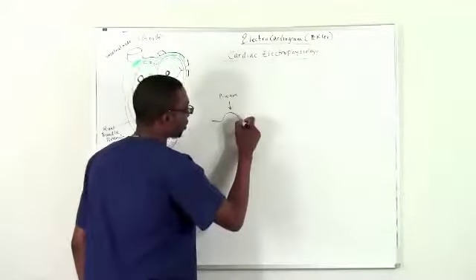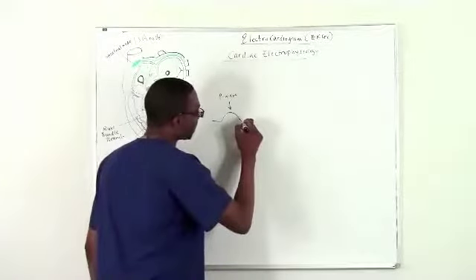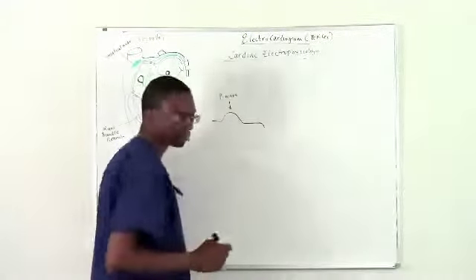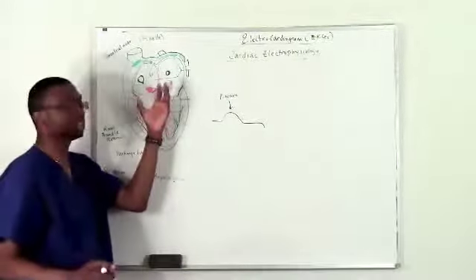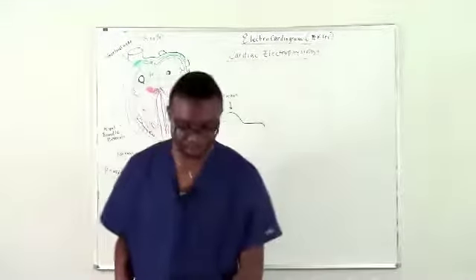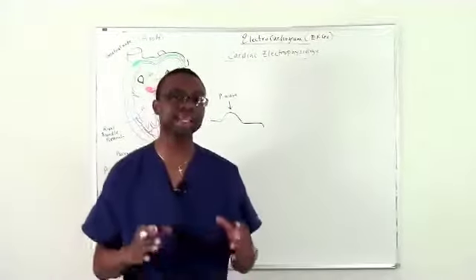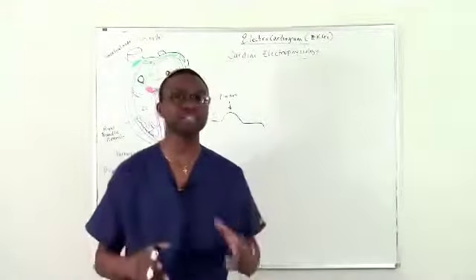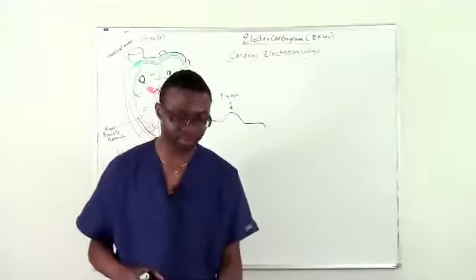And then we move forward on the EKG, and we see this line that goes straight forward and makes a little dip. Now, when the atrium depolarizes, we also get atrial repolarization, but we often don't see atrial repolarization on the EKG. It's often buried somewhere, which I'm going to talk about in a minute.